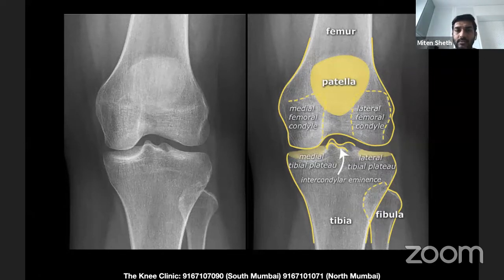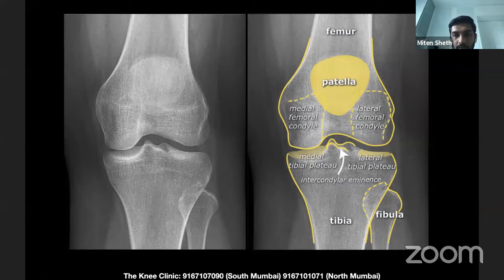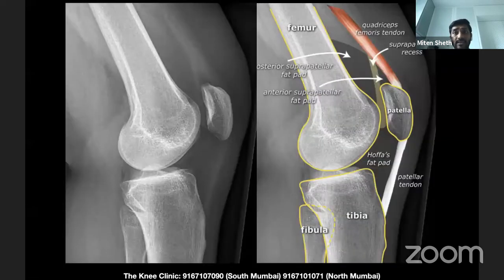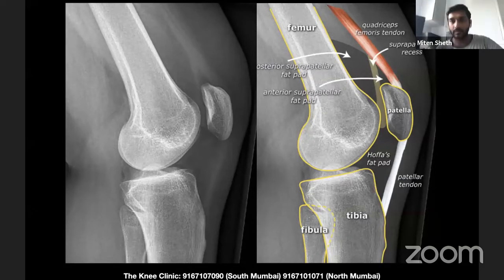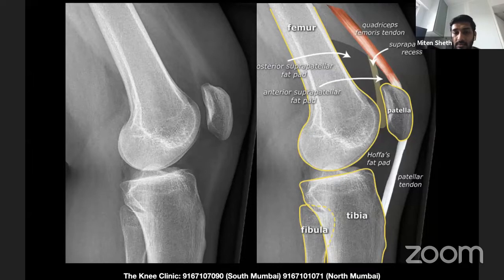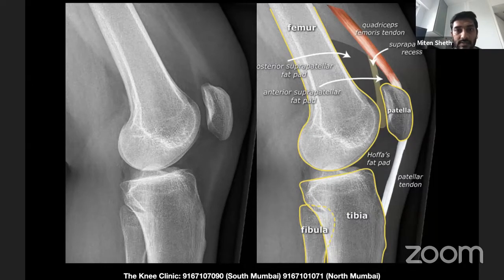On the femoral side we're looking at the medial femoral condyle and the lateral femoral condyle, the medial tibial plateau and the lateral tibial plateau. On the tibial side there's something in the center apart from these two plateaus — we call that the intercondylar area, or the intercondylar eminence. On the lateral X-ray we look at the patella, femur, and tibia, including the patellar tendon extending to the tibial tuberosity and the quadriceps femoris tendon extending superior to the patella.